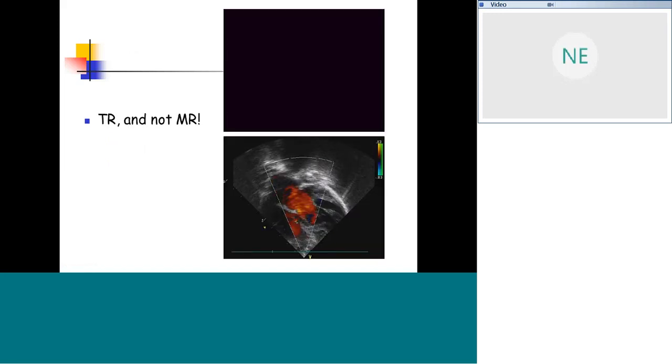Now coming down here, just an unusual scenario where you can see that the left AV valve is leaking, and you will feel like telling this is tricuspid regurgitation, mitral regurgitation, but it's not mitral regurgitation. You can typically see that the left-sided AV valve is below the right side, and you can here see the atrioventricular septum, which is the other way.